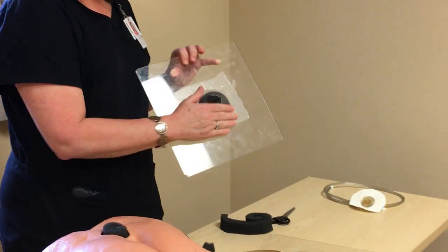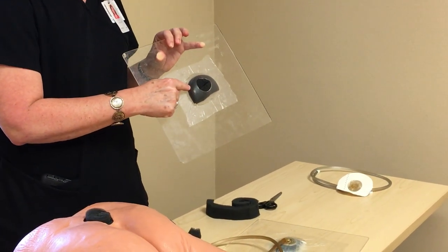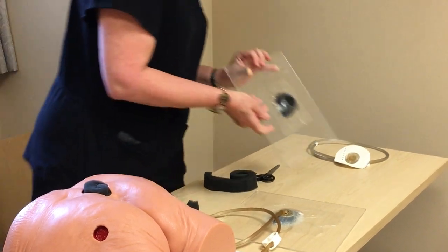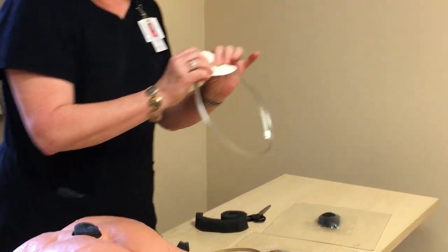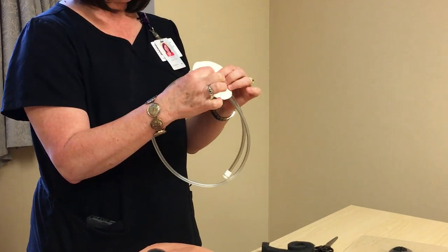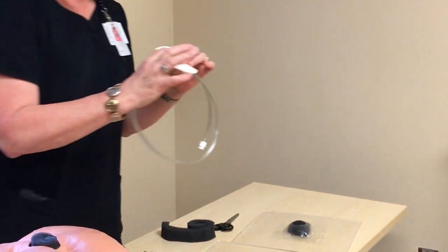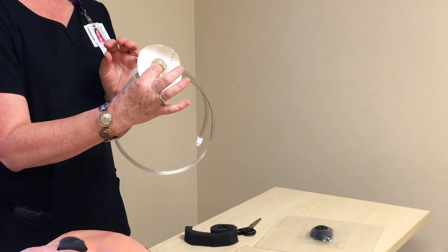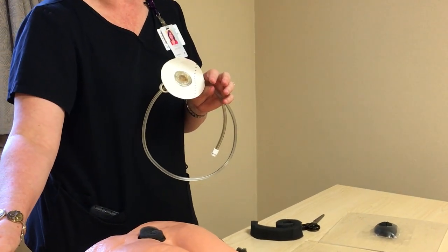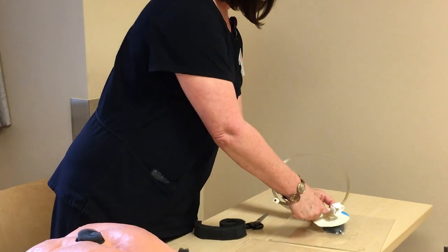What I want you to do — once it's sealed — is cut at least a quarter-size hole to put your track pad on. In the track pad, you'll see two small openings on the inside. If you don't cut your hole big enough, the drape will actually block one of those openings and you'll get a blocked tubing alarm with your pump. So make sure you cut at least a quarter-size hole.